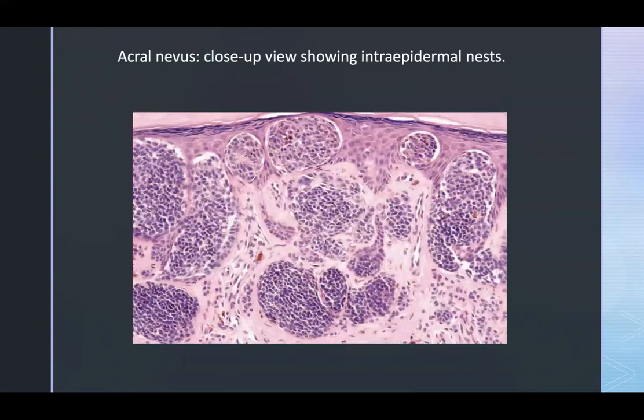And this is usually when benign melanocytes look scary to the untrained eye, that's called a special site nevus. So on special sites, you can see large atypical looking nests and asymmetry. It looks like pagetoid spread, but the important thing is that these melanocytes are bland. You don't find mitotic figures very easily. And if you were to do a PRAME immunohistochemistry, this would be stone cold negative, probably 95 out of 100 times. If you get any detection at all, it's probably going to be very sparse and faint.